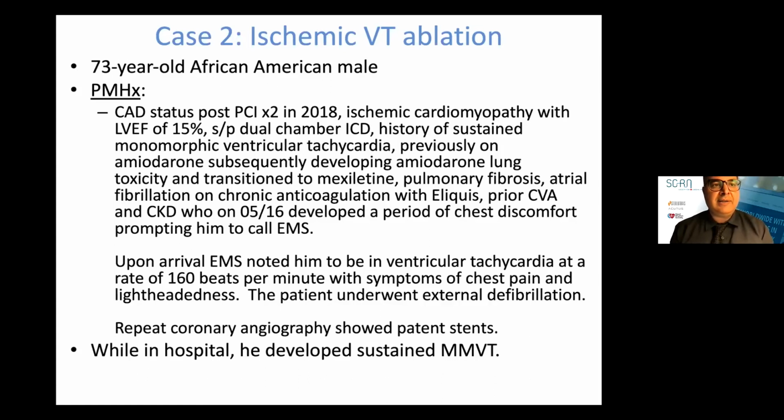It's really the RA lead, because of the U shape that it creates. Sometimes the sheath tangles with it and pulls it down. But I do extraction also, and these leads, 6 months, 7 months, a year out, are very difficult to take out. So these are very stable. And as I said, if you know that the leads are there, which you do see, as I just showed you in the case, this patient also has leads, so you will see the same issue. You look for them actively. So the LV lead is not a problem. RV lead is not the problem.